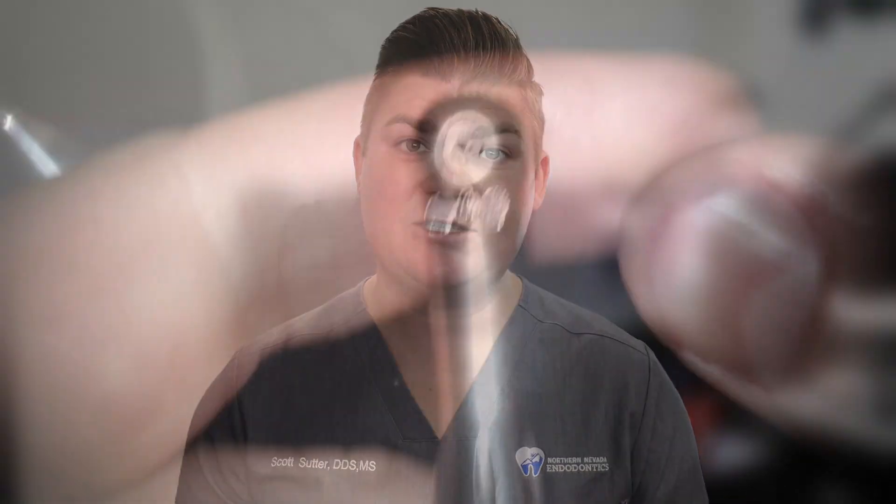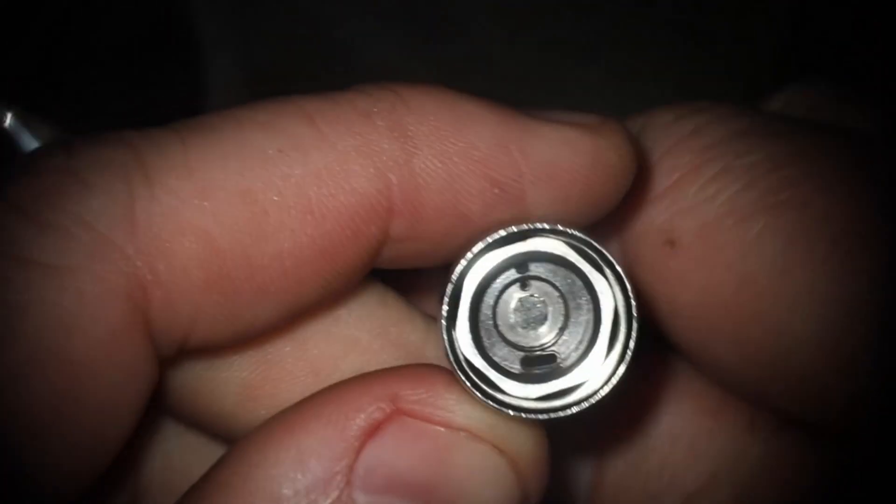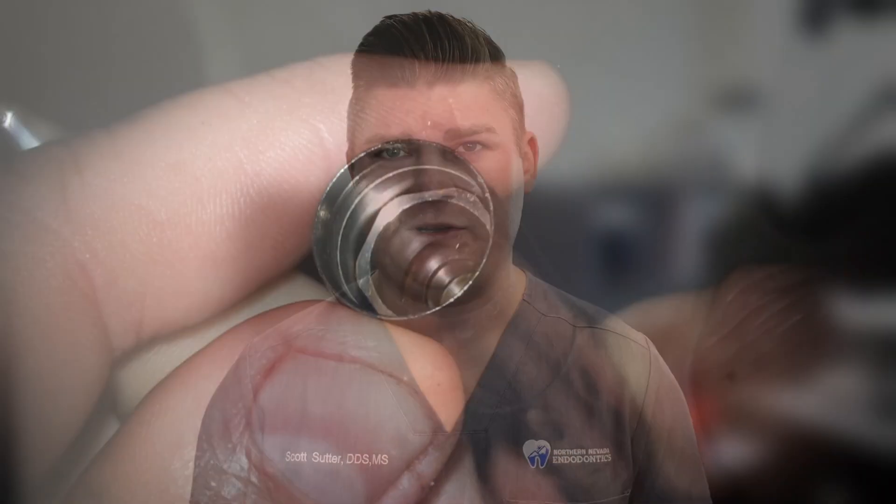The first step is to examine the inside of the handpiece to make sure there's no debris. Usually this is cleaned out during sterilization, so it's not that common of an issue. However, you're going to be cleaning it out anyway, so may as well look in there and make sure everything looks clean.